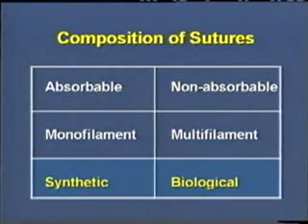Synthetic absorbable suture materials, which closely resemble naturally occurring body substances, can be produced chemically. These can be absorbed without the tissue reactions often associated with natural fibers. The advantage of synthetic absorbable sutures is that they have very predictable strength retention and absorption profiles. In addition, they tend to be very strong materials which virtually eliminate the risk of adverse reactions.